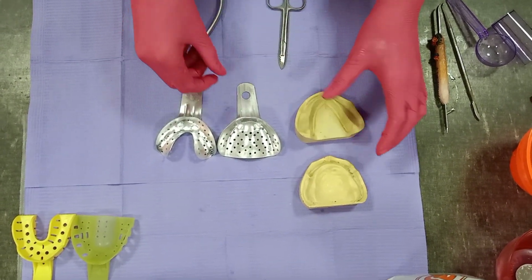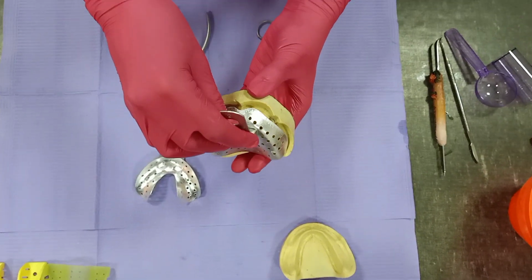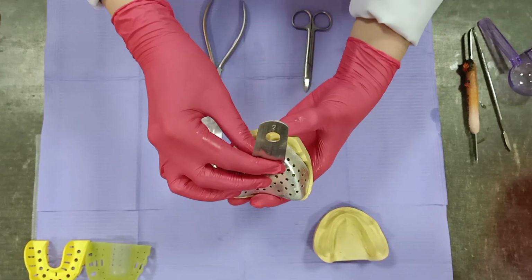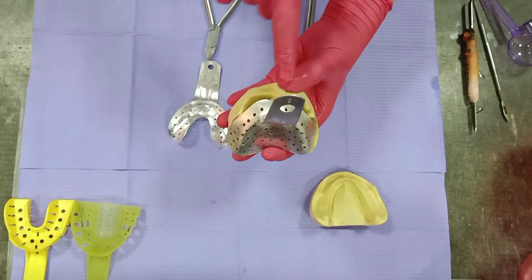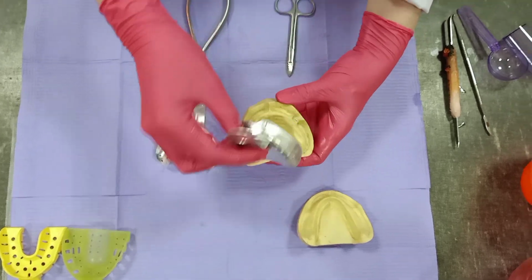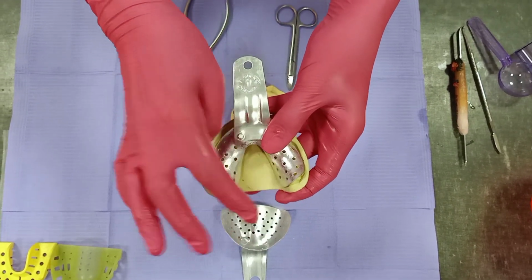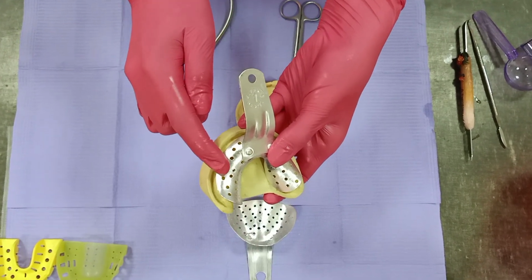To modify the tray, we are going to use pliers and scissors. To be sure that your tray is the proper size, it has to cover the tuberosity in the upper and all the sulcus area in the cast from right, left, and anterior. Now we have selected this for the upper, and for the lower, your tray should cover all the ridge area and the retromolar area and have proper space between the ridge and the tray itself.